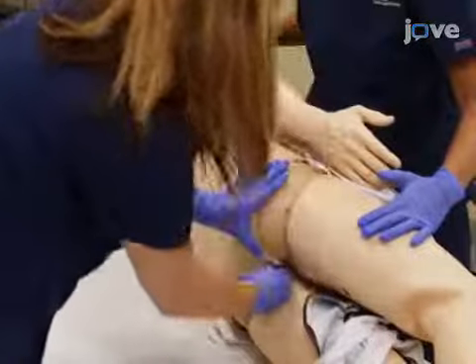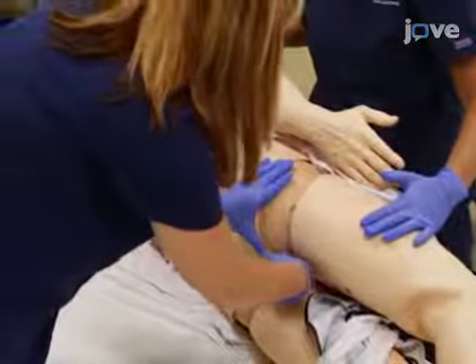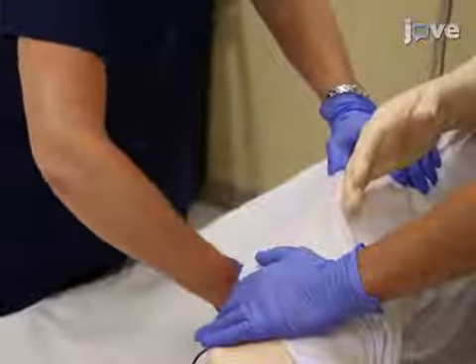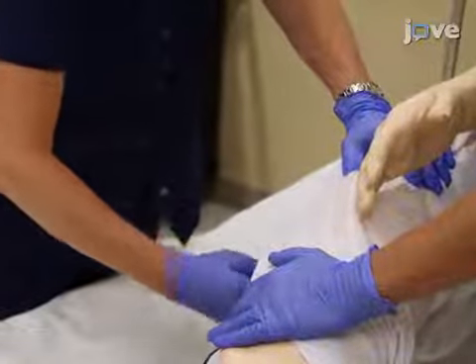First, assess the rectum for stool using a standard digital exam. It is best if the rectum is empty. However, formed stool is not a contraindication for use. Prior to insertion, assess the rectal opening for contraindications, which include lesions, tumors, abscesses, rectal bleeding, diarrhea, or bowel surgery within the last 6 weeks.